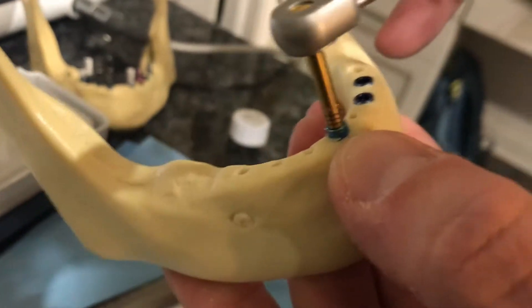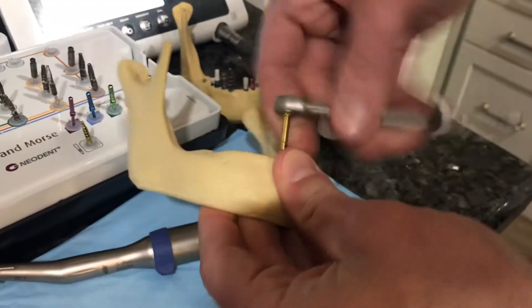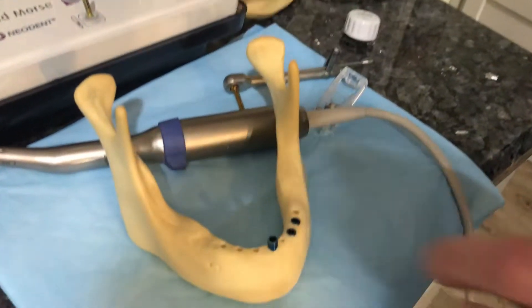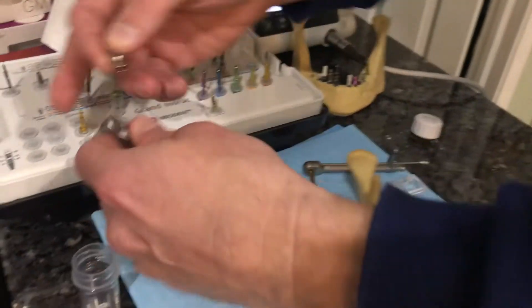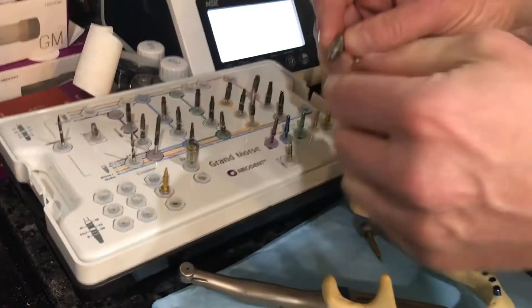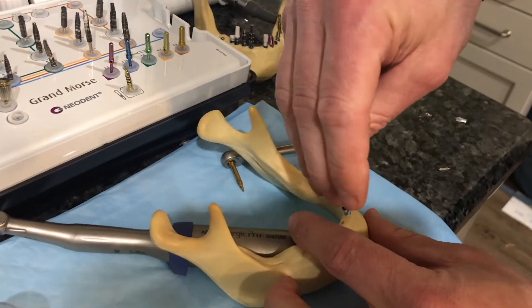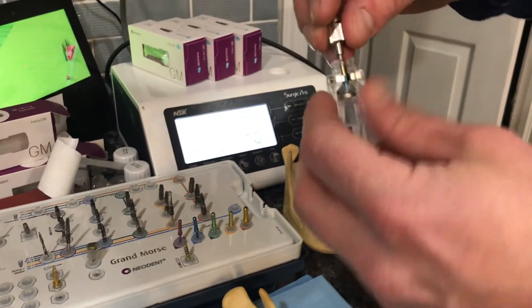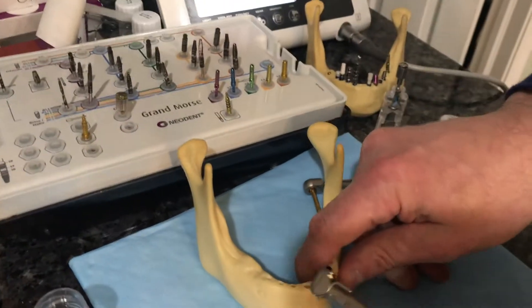If there are several millimeters of implant still above the bone and I need to prepare the osteotomy more, I back the implant up. We have an adapter inside the kit that allows me to take the same driver in a latch type, slide it into the adapter, grab the implant, back it up, and take it out of the osteotomy — knowing it won't fall out. I put it back in its sleeve and set it aside while I go back and prepare the osteotomy more.